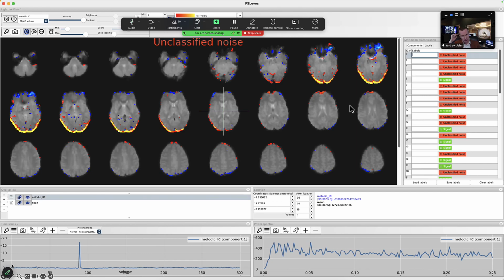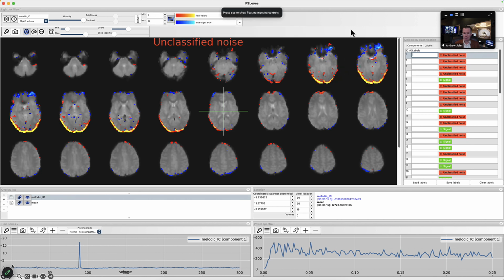Okay. Before I move on from the Human Connectome project, I did want to point out one thing because it's a technique I've been using lately, which is how to denoise data. You may have noticed one of the listed data sets was called fix cleaned. And what that means is that it was trained using a machine learning classifier to identify things like movement artifacts, physiological artifacts, other kinds of noise from the scanner, filter out from the data so that what you're left with is a cleaned data set.